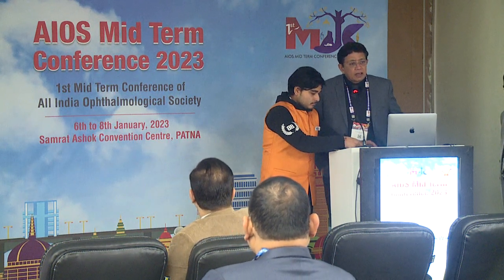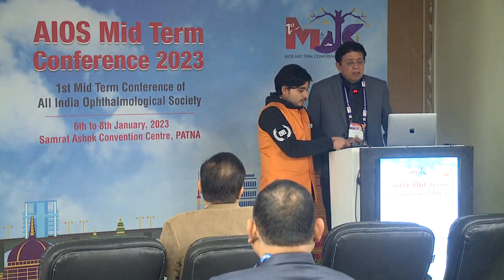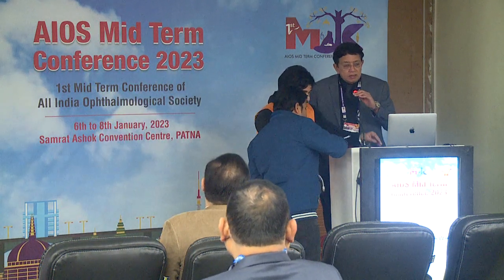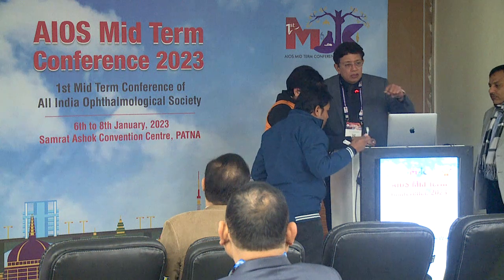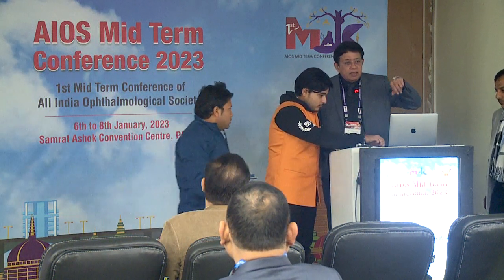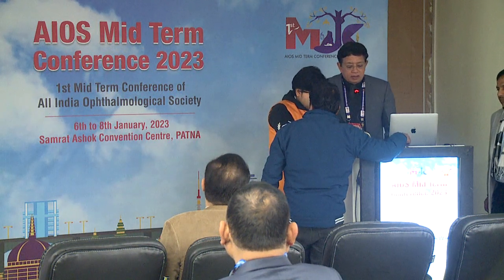I like the way you maintain the anterior chamber right through the procedure, while taking out your instruments and whenever the PC rent occurred. I'm making these comments because we have the time. One good thing about these PC rents in posterior polar cataracts is that it's usually pole to pole. There's no question of extension or rounding it off and converting it to a posterior capsular rhexis, etc.